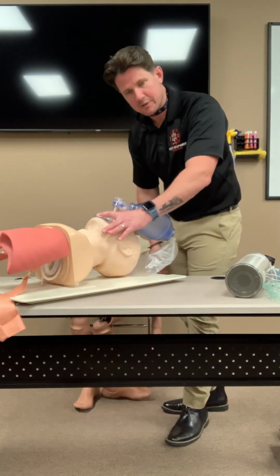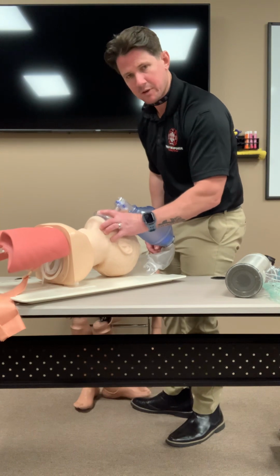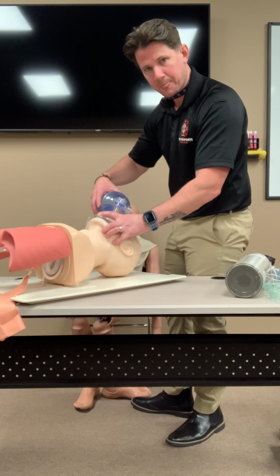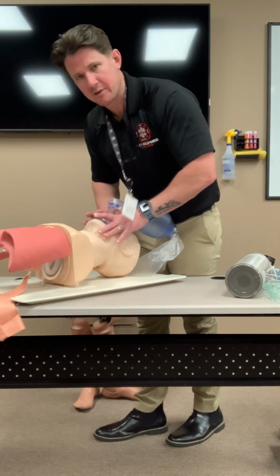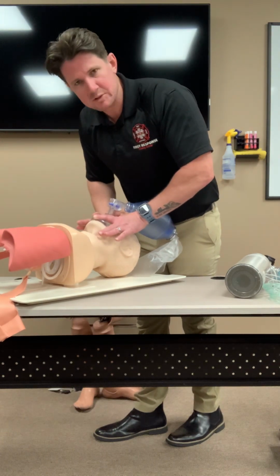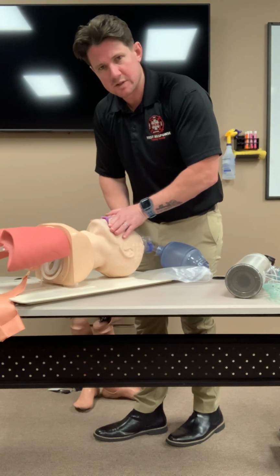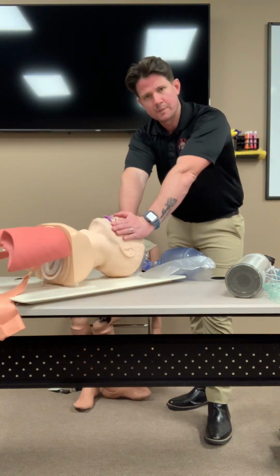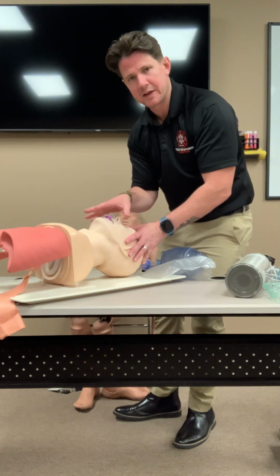You want to set yourself up for success. That's the best way to set yourself up for success. Then I'm going to use my 3 fingers, and I'm going to lift the jaw up, pulling the jaw into the mask. That's another key, okay? What too many people do is it's very intuitive to lean into the mask and push into the mask, or into their face. What happens when we do that is we smush all of their soft oral facial tissues together, and we actually end up occluding their airway and fighting ourselves. So remember, it's pulling the jaw into the mask, not pushing the mask into the face.